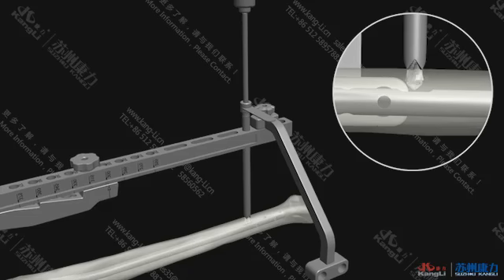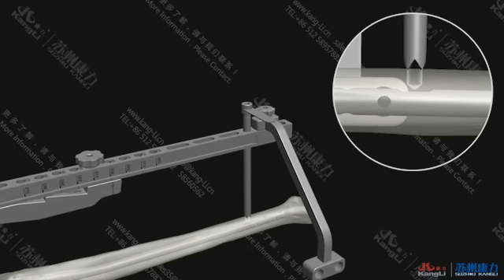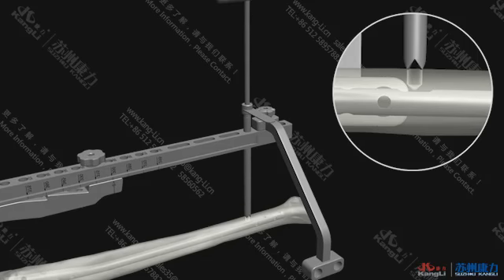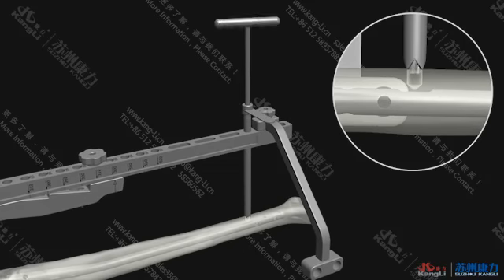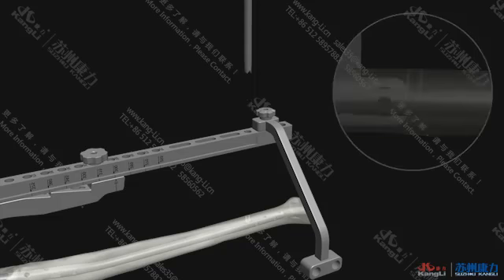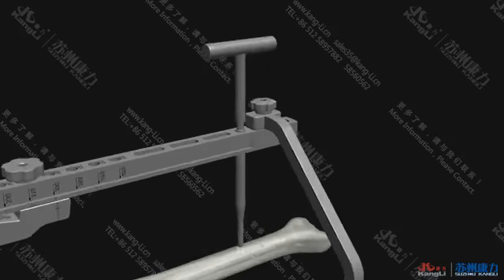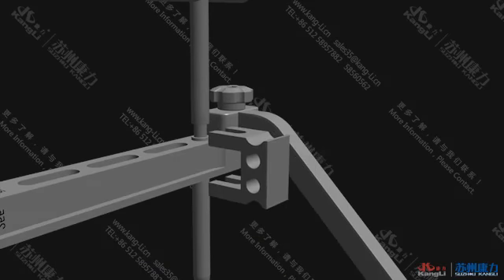Remove the 5.2 drill bit. Insert the spot facing to clean the residues. If a metal noise is heard, it can be confirmed that the spot facing has reached the positioning platform. Finally, insert the T-positioning rod and install the U-fixture block, then positioning is finished.